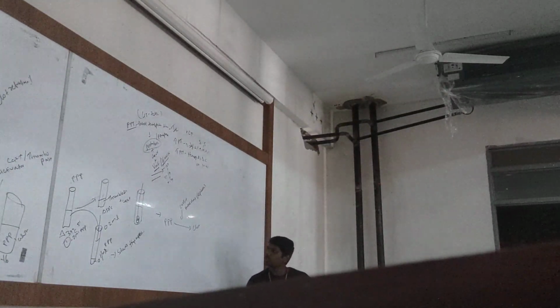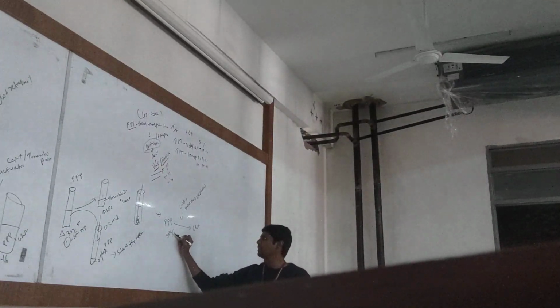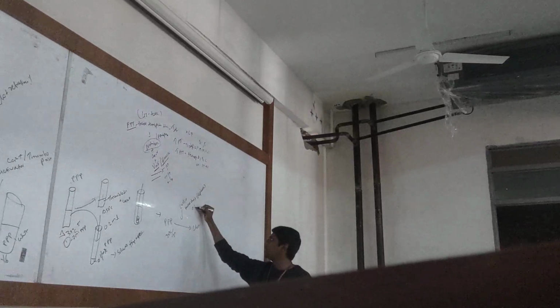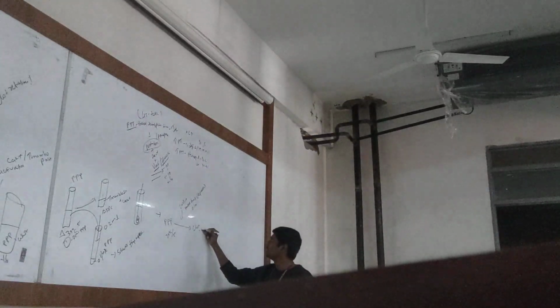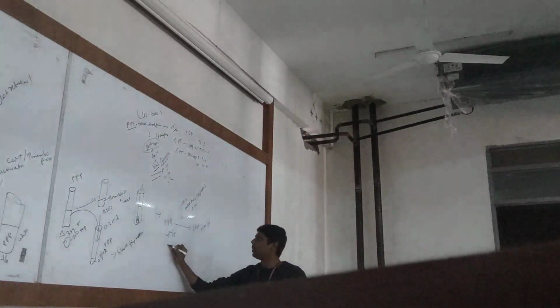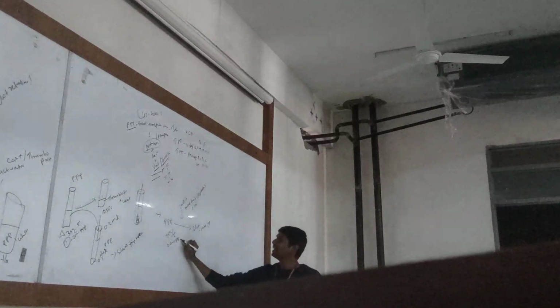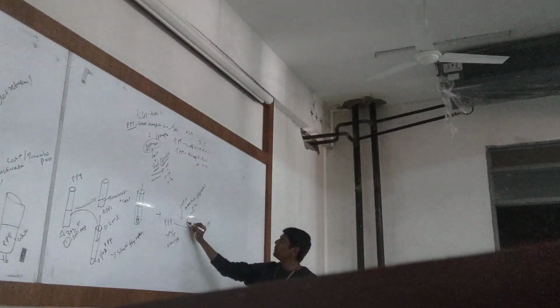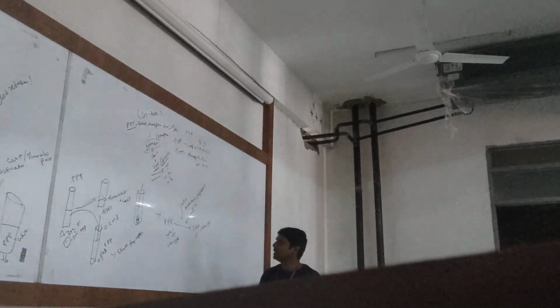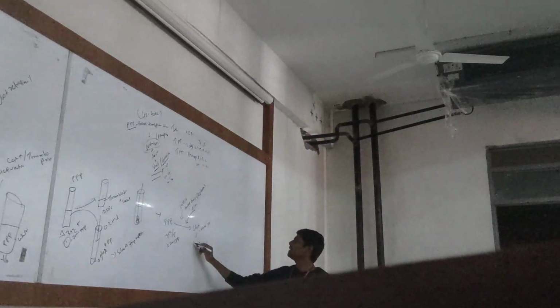Okay. So that's it. Same. Again 37 degrees centigrade temperature for 5 minutes. Then again we will take 0.1 ml of partial thromboplastin to 0.2 ml of PPP. We will add 0.1 ml of reagent and we will get the clot. The normal time of this one is 45 to 70 seconds. That's it. This is partial thromboplastin time.